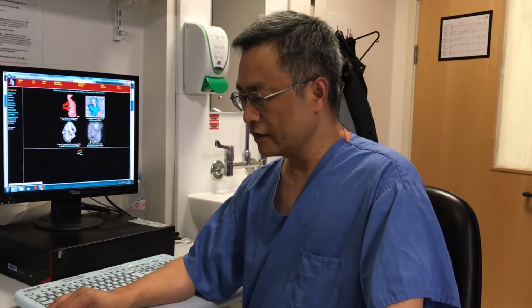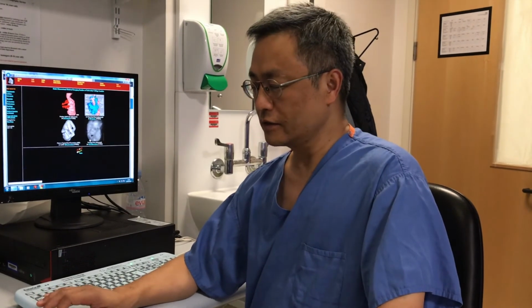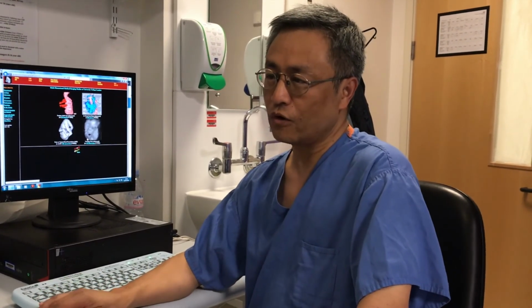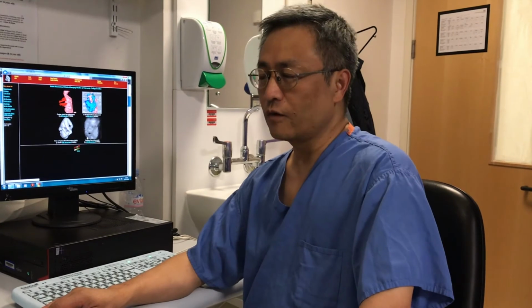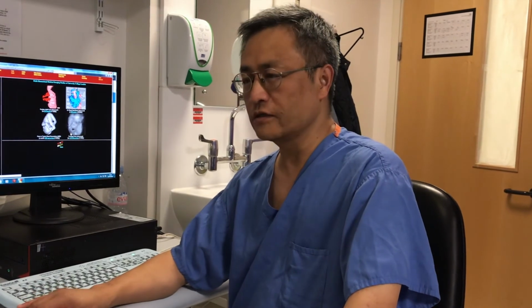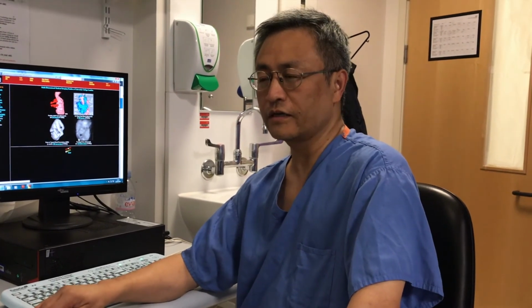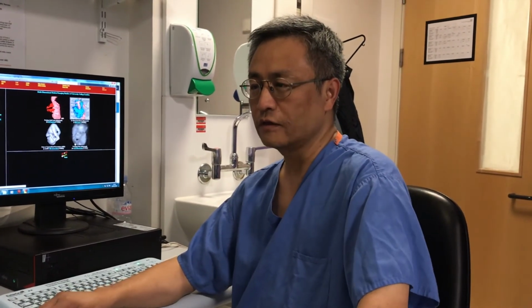And in terms of clinical application, fetal heart movement is very complex and structurally complex. And also because it's beating so fast, if you use a conventional 3D imaging approach, you will get images with motion artifacts. So that's why we need 4D to remove motion artifacts. Ultrasound is a very safe imaging modality. Unlike X-ray, it doesn't have ionizing side effects. So that's why ultrasound is used in fetal study or imaging as a first line.